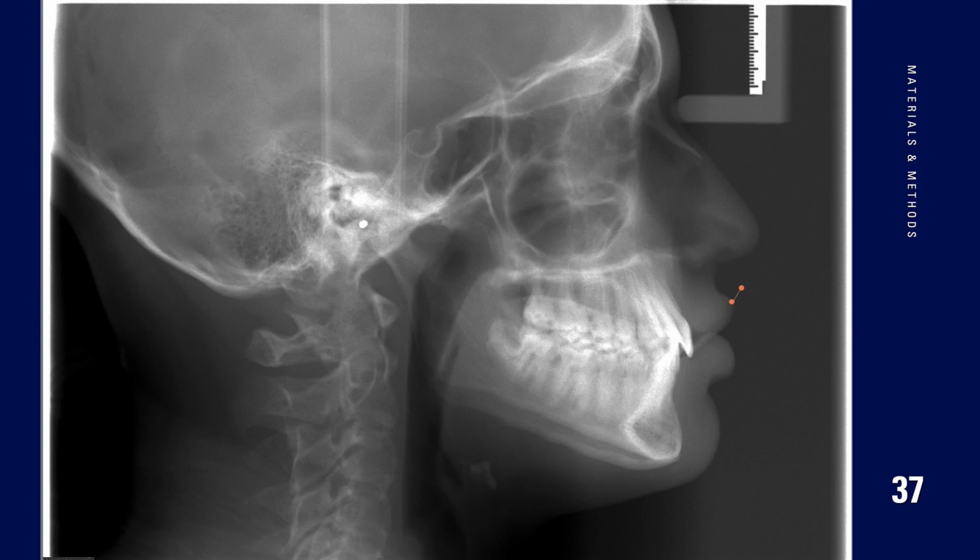Multiple studies also report accuracy by calculating point-to-point error values in millimeters. So basically the pixel distance between the predicted and true location of a point is measured, and this pixel distance is converted to millimeters using a conversion factor that depends on the resolution of the image. Since most studies only collect radiographs from a single center, the resolution of all their radiographs is the same, making this conversion easy. However, our study was novel in that it had a multi-center approach, which strengthened the model but complicated this conversion as each machine captures radiographs at different resolutions. To combat this, we found the average resolution and used that for our conversions.